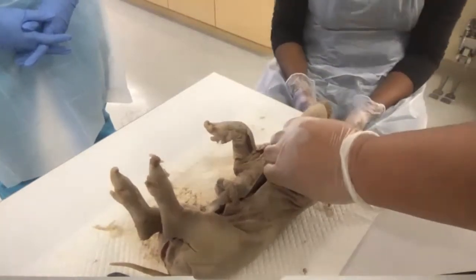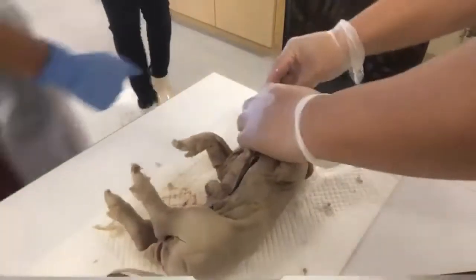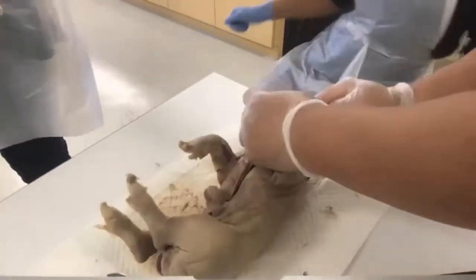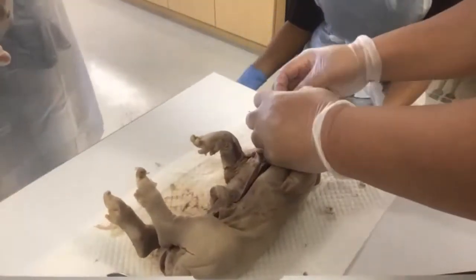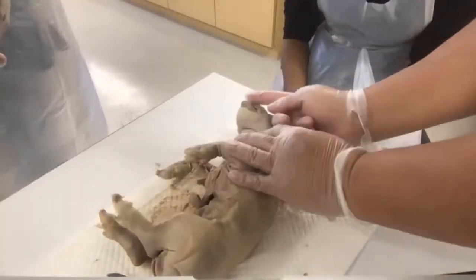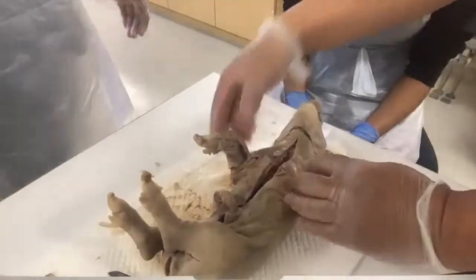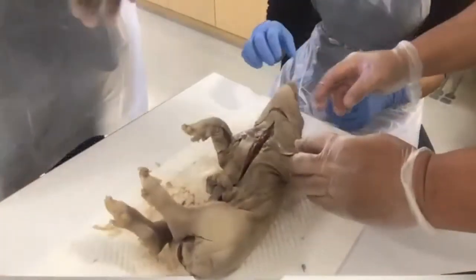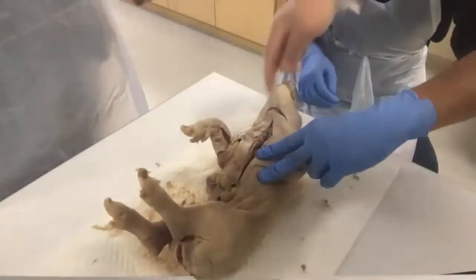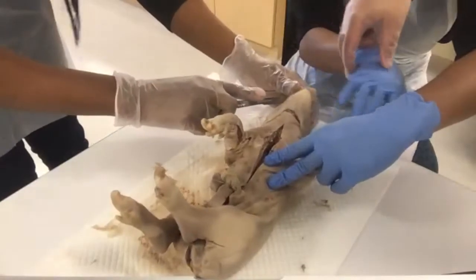You now are the surgeon, and who wants to be the assist? Now, the next thing you're going to do is I want you to cut here and cut here, and then be careful of a little tube. I want you to try to open his jaw like a Pez dispenser. Like, whoop. So cut here and cut here, right? Adam, kindly hold it so, yep, here you go. So pick one side, yeah, this side, and then she can then switch her hands.